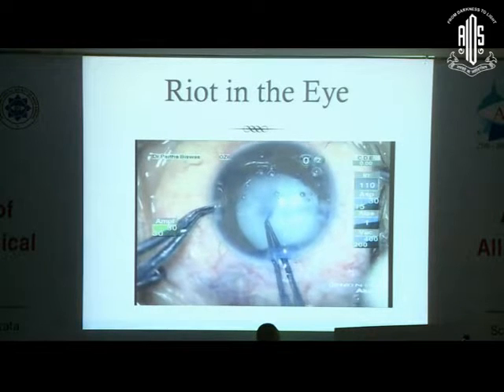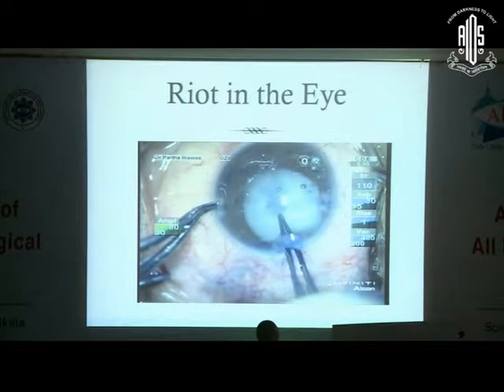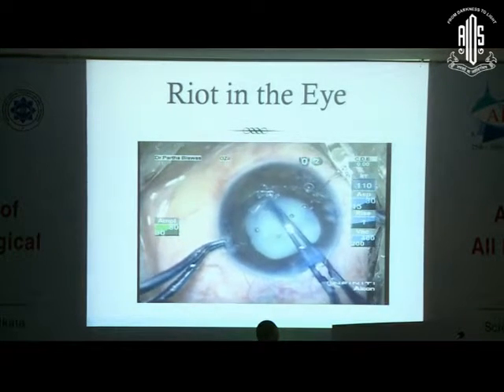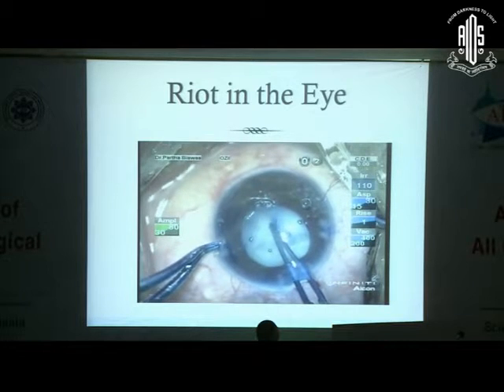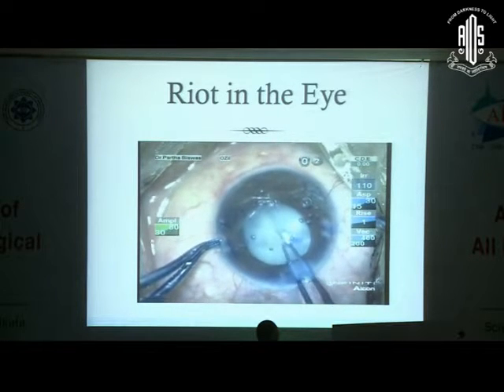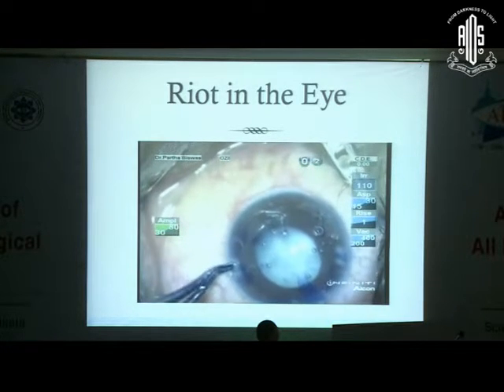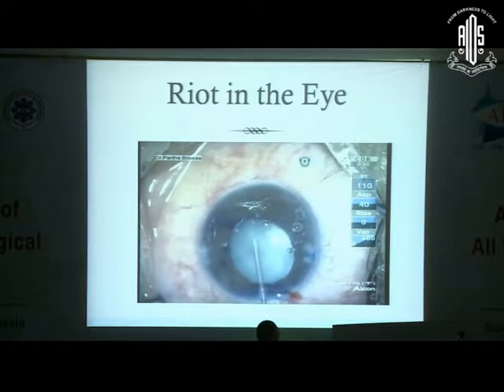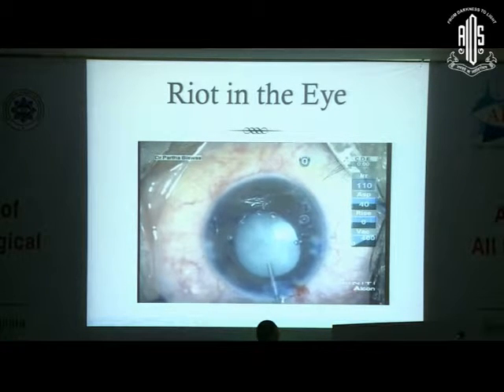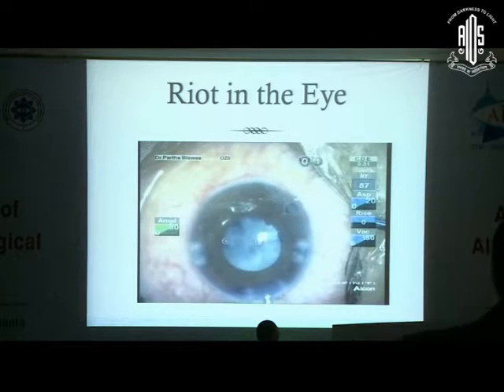Next I used the Utrata forceps to gradually fashion the rhexis — the toughest part of the case. If I could get this right, I knew I had won the battle. But as it completed half the circle, things went wrong. Remember, this was the area where the synechia had been. There was some adhesion, and the rhexis ran out in another quadrant. So we had two rhexis runouts — one on the left side and the other on the nasal side — and the pupil was shrinking. I now had an open capsular bag with a hypermature cataract.